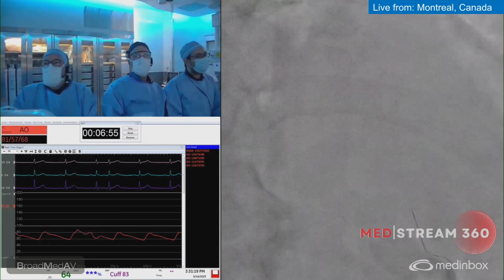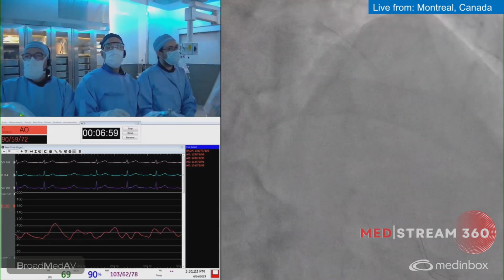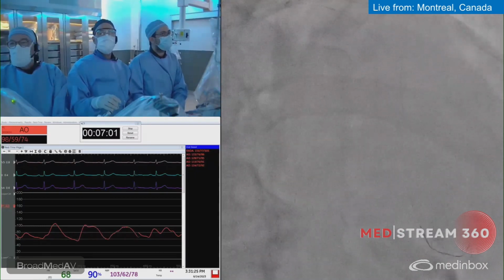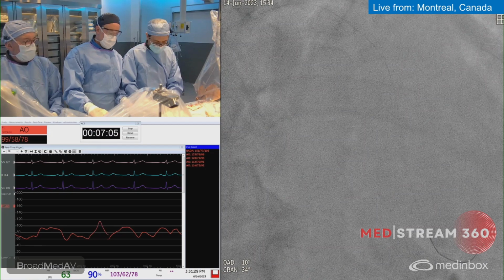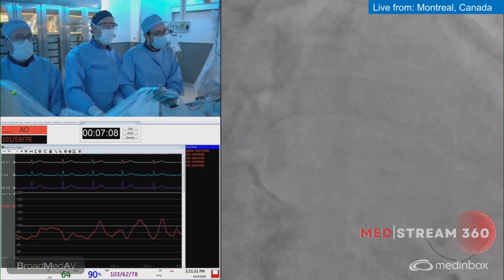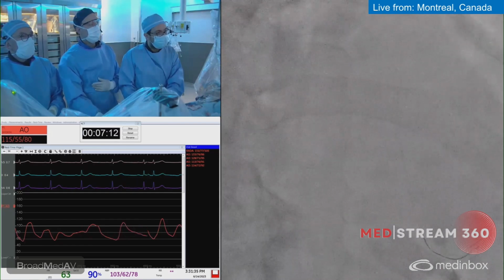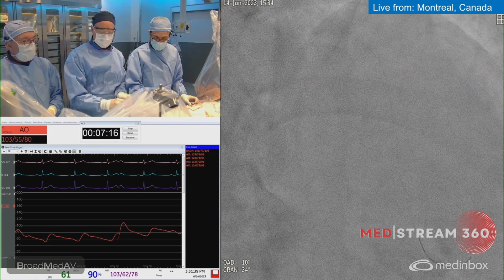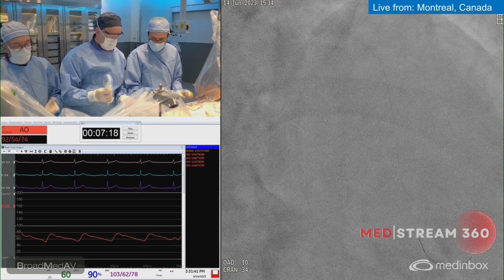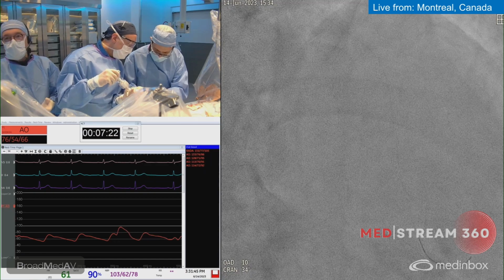I think that's a question for the... Oh, how does the efficiency of orbital atherectomy compare to that of balloon angioplasty? That's a good question. So we need a randomized trial to answer that question, right? And we don't have any so far. The Eclipse trial, I think it's close to be completed or already completed. So we need to have some randomized data. That's for sure. At the same time, the art of angioplasty, sometimes we do things without the data.